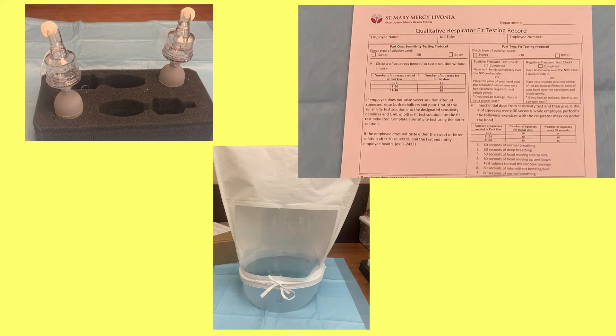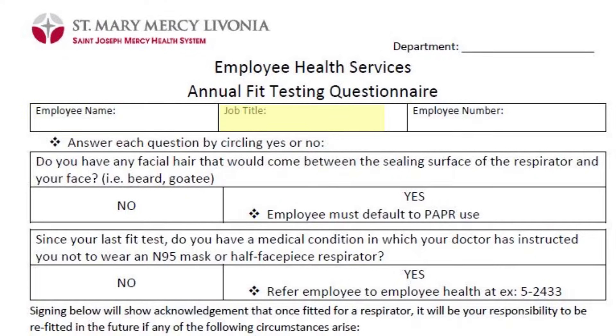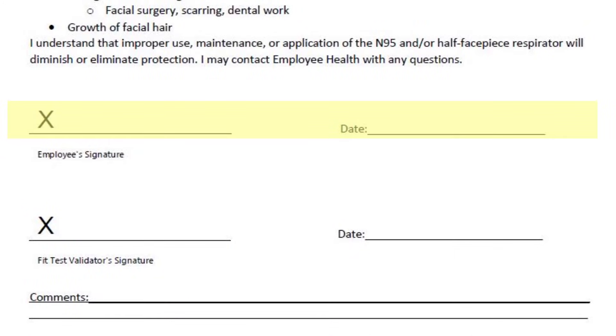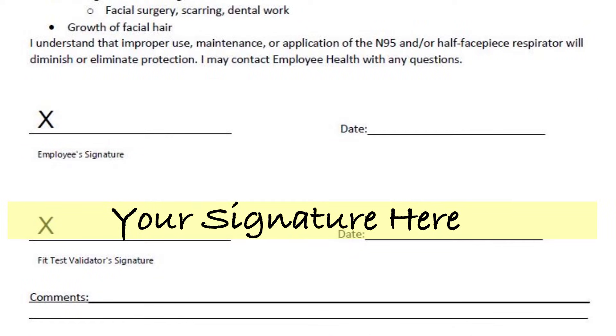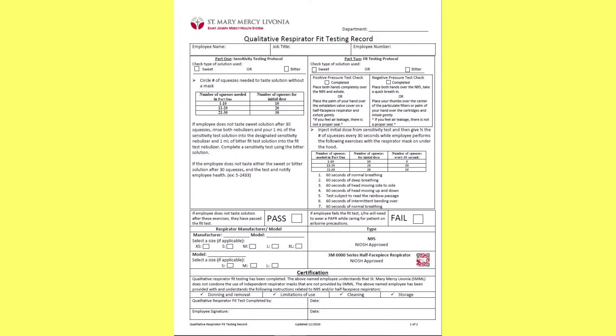Your supplies are gathered and ready to be used. Bring in your colleague and have them fill out the necessary items on the qualitative fit testing form. One side will require their name, job, department, employee ID number, and answers to two questions before signing at the bottom. The other side will only need them to fill out the top portion at this time, which requires their name, job title, employee number, and department. You can use the form to help walk you through the steps of a fit test.